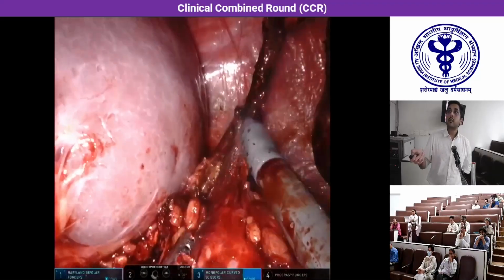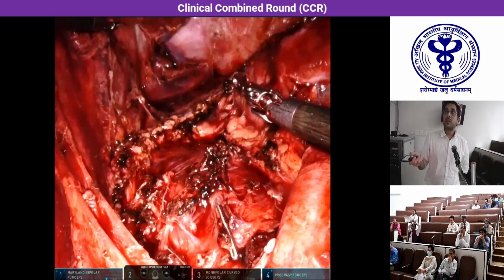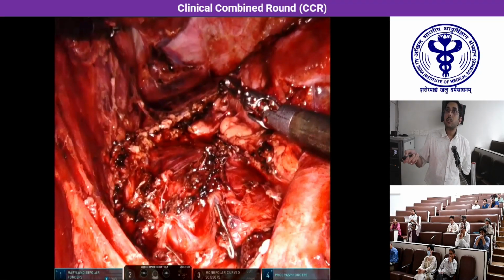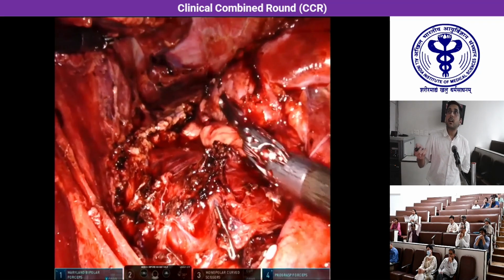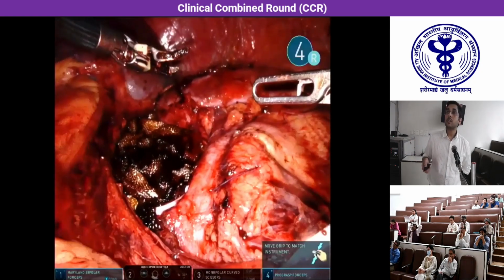That's the end of the tumor, where we bag the specimen, and that's the abdominal aorta. This is the liver and the spleen and the pancreas and the kidney and the hilar structures on that side.